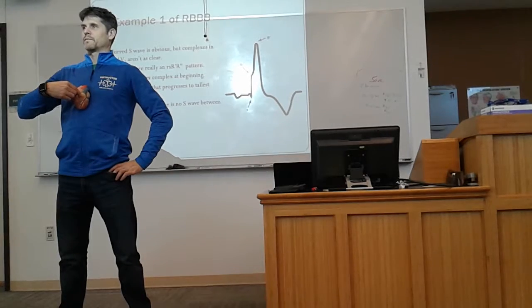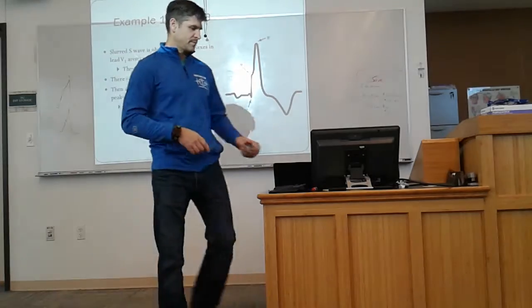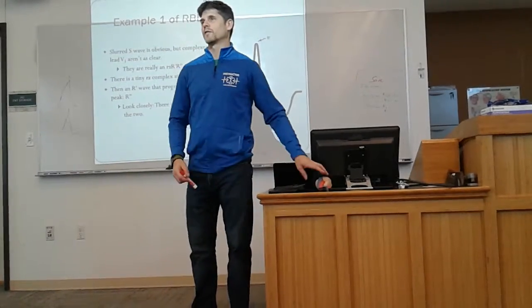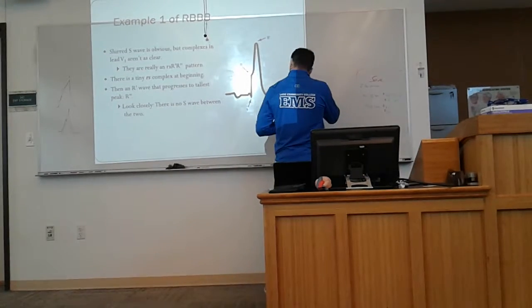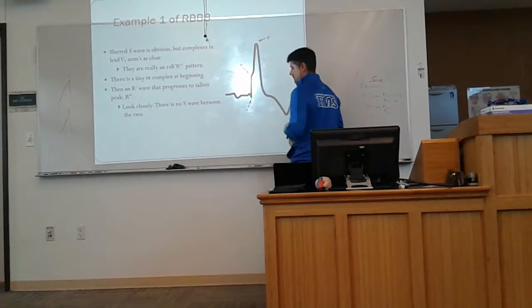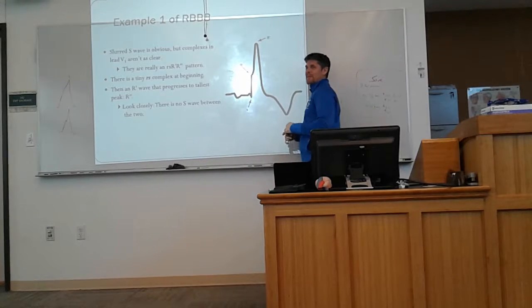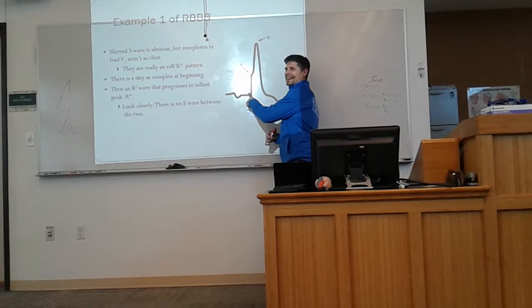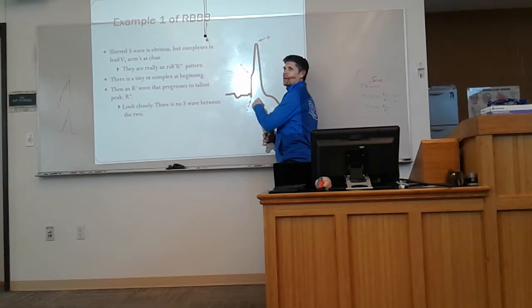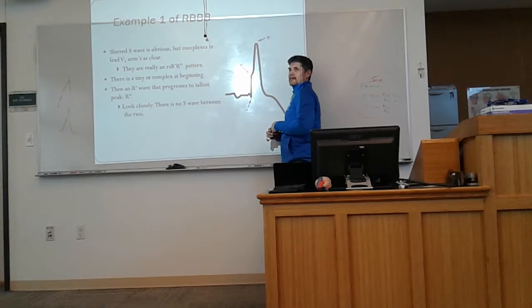And your T wave should be inverted. And oftentimes the T wave is too. Not always, but sometimes. How are you confident that that is not a hidden P wave? Because my P waves are there. But what if you got a heart block going? If that were a P wave, first of all, it wouldn't be as peaked as it is.